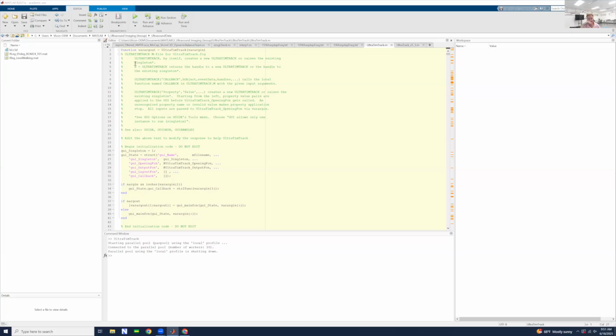With this software that we're going to be using, again, this is optical flow. It involves a bit of drift problems, but it's insensitive to noise. And there's going to be some discrepancies between this software versus using UltraTimTrack's optical flow. Even though they're using the exact same method, there's something about the fusion of methods used by UltraTimTrack at the moment that limits us from going into full optical flow, or at least it being the exact same output as I get from this UltraTrack software that I'm about to show you.